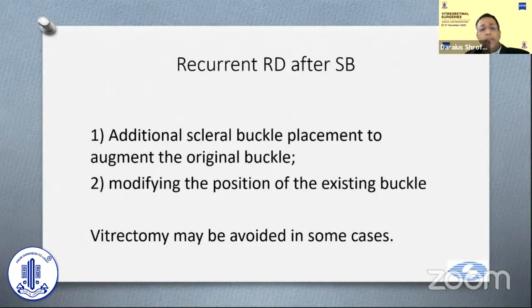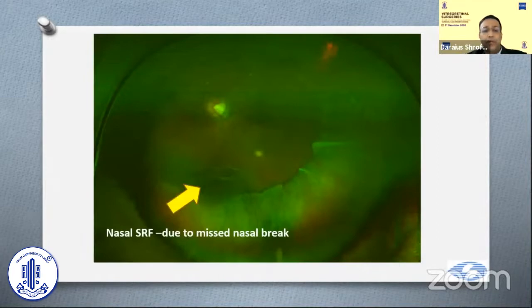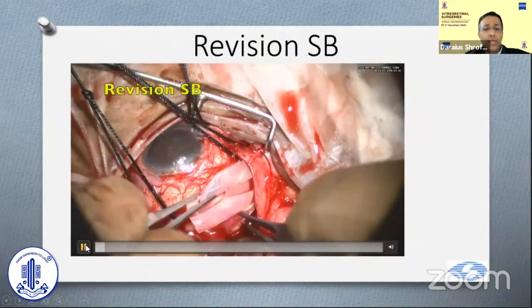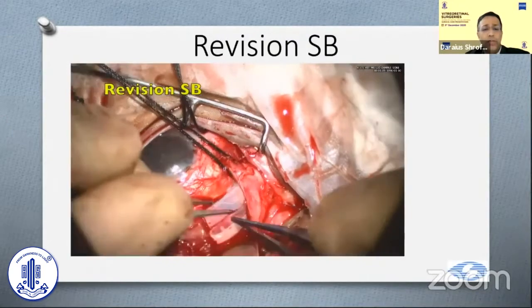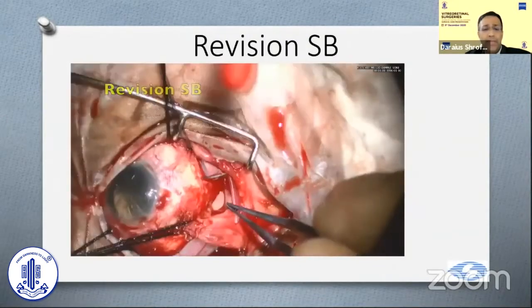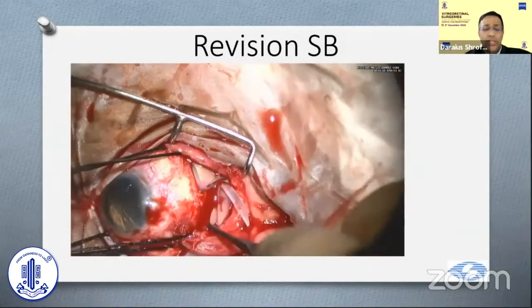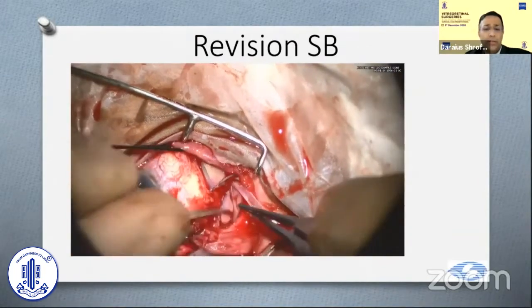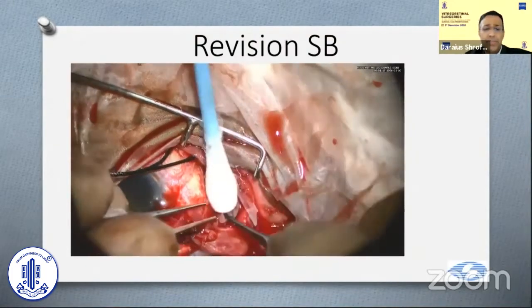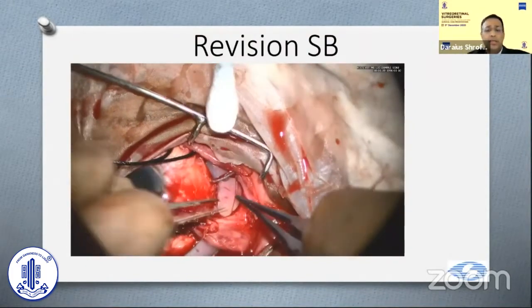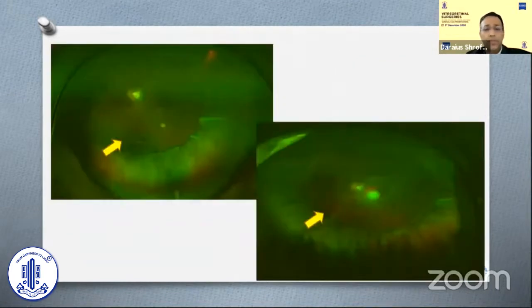Recurrent RD after buckle — addition of a buckle element. Aditya said buckle has become very rare, but we are still a little old-fashioned and still do it quite often. This is a phakic patient, 47 years old. After buckling, you can see the buckle effect but there was still some nasal fluid. We didn't want to do a vitrectomy or touch the lens, so we did a revision buckle where a new buckle element was added in the nasal quadrant, covering a missed break located superior nasally. You can see the post-op Optos picture with a well-attached retina and restoration of vision.